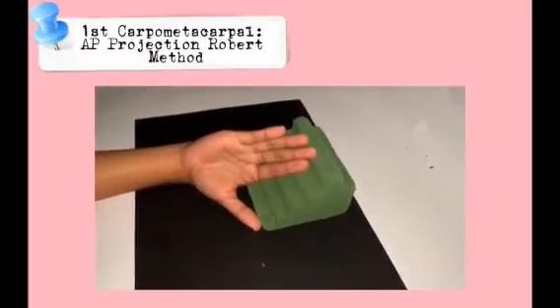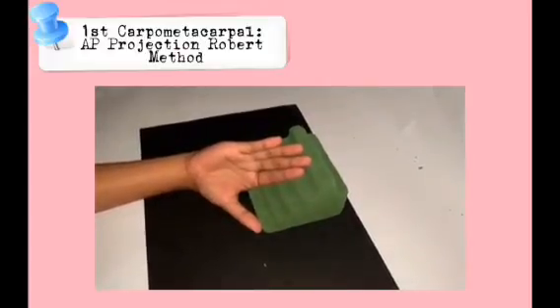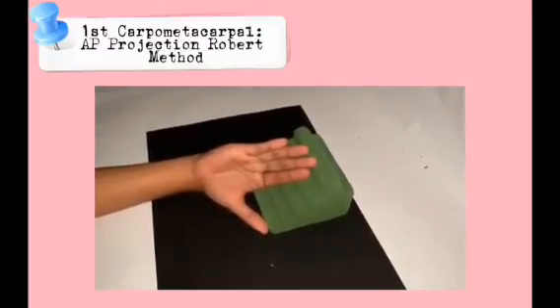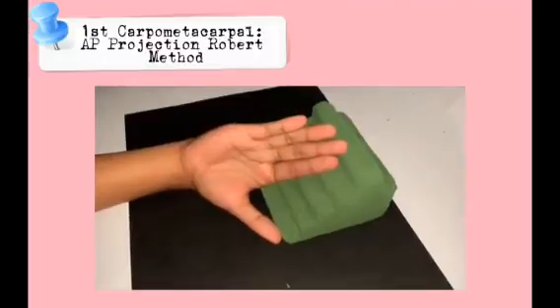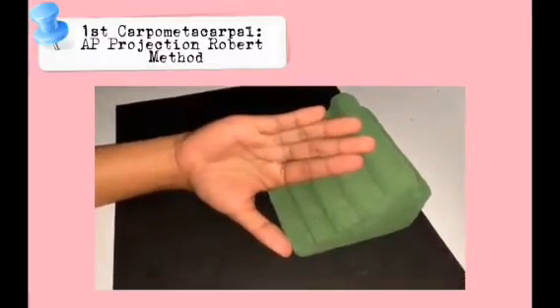Position of part. Extend the limb straight out on the radiographic table. Rotate the arm internally to place the posterior aspect of the thumb on the IR with the thumbnail down. Place the thumb in the center of the IR. Hyperextend the hand so that the soft tissue over the ulnar aspect does not obscure the first carpometacarpal joint and ensure that the thumb is not oblique.